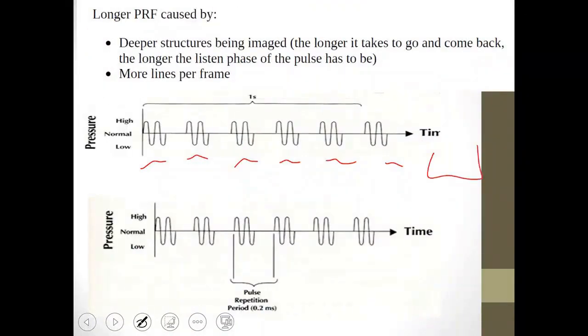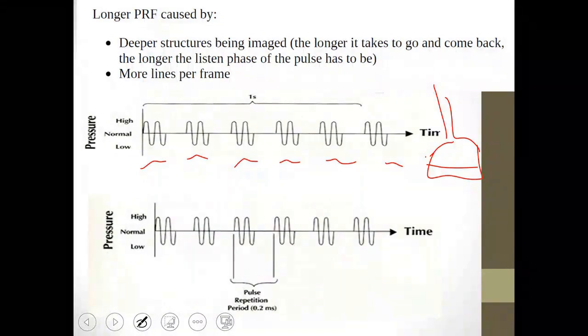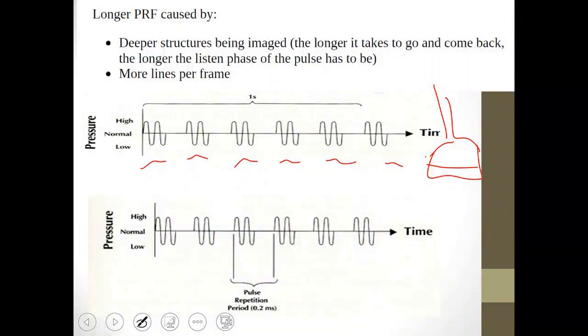What does your transducer or probe ultimately give you? It gives us an image, right? When you are using the transducer during the imaging process, do you find that when you place the probe on the patient's body, the images don't appear immediately? Do they disappear or take time to show up? I mean, while you are holding the probe and the frames are running, the images appear, right? Or am I wrong? The images appear fine.